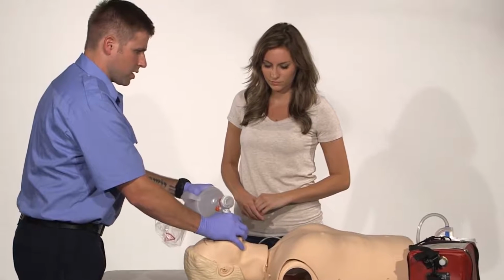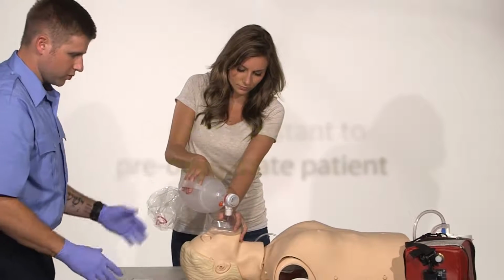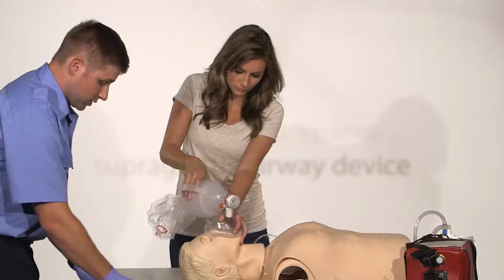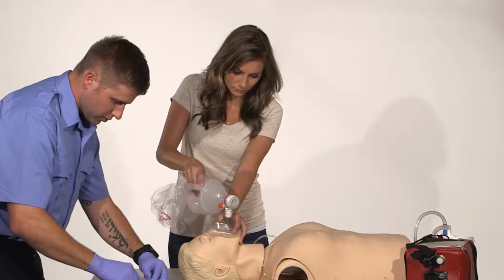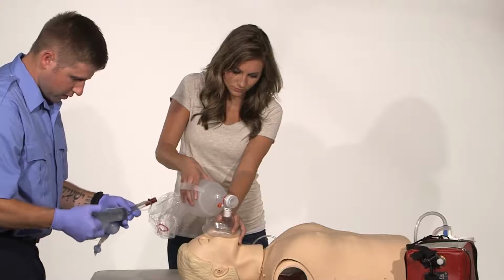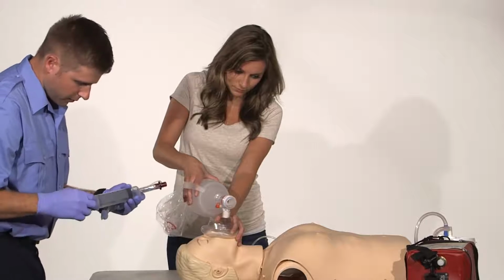Okay. I'm going to instruct my partner to pre-oxygenate the patient. While she's pre-oxygenating the patient, I'm going to check my equipment, select the correct size King airway. So I'm going to inflate the cuff 60 to 80. Check, just make sure there's no leaks, no cracks. Everything's good. Okay.